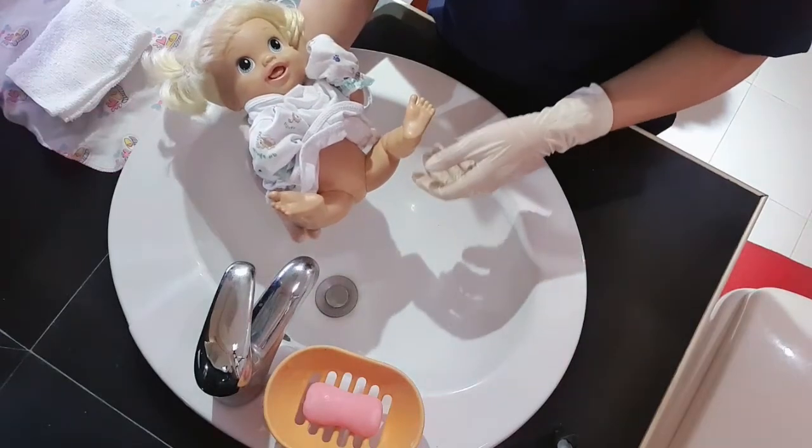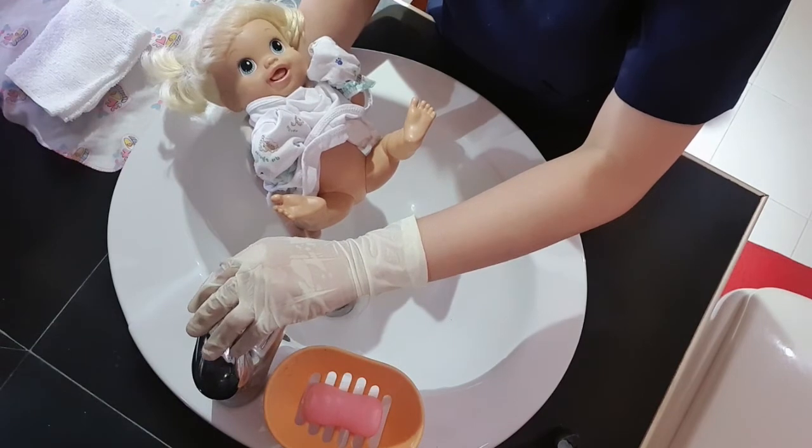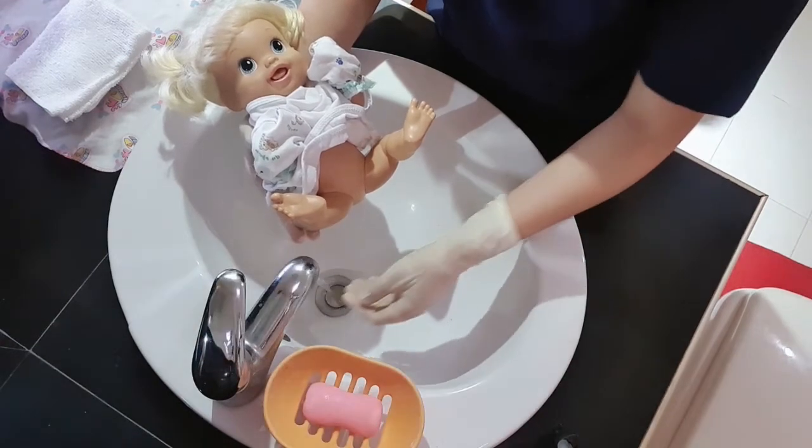Then provide privacy to avoid unnecessary exposure of the body parts. Here I have already closed the curtains and the doors to provide privacy to my patient. Next is to wash perineal area thoroughly with soap and water as needed. Washing ensures the area is not contaminated before putting the wee bag.